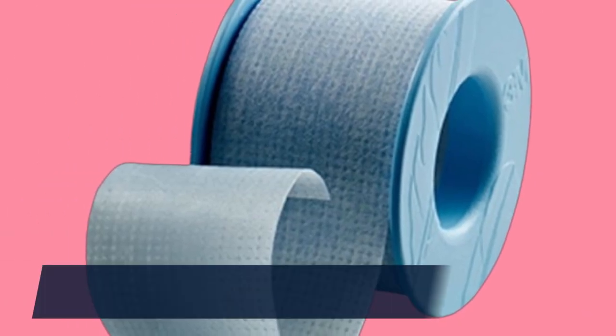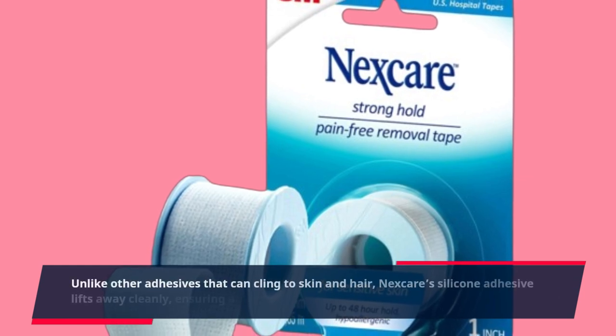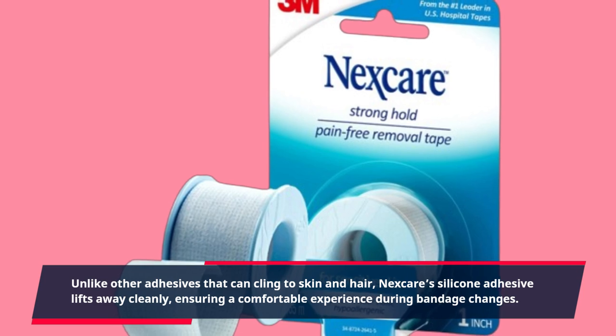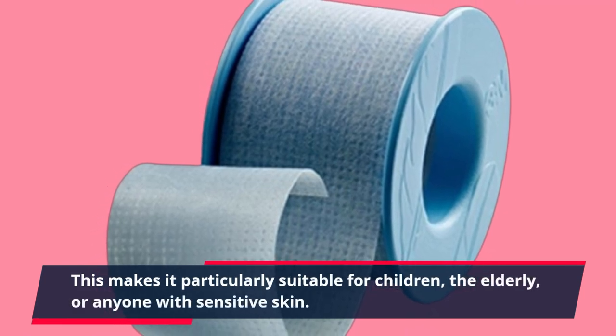One of the standout aspects of this tape is its pain-free removal. Unlike other adhesives that can cling to skin and hair, Nexcare's silicone adhesive lifts away cleanly, ensuring a comfortable experience during bandage changes. This makes it particularly suitable for children, the elderly, or anyone with sensitive skin.